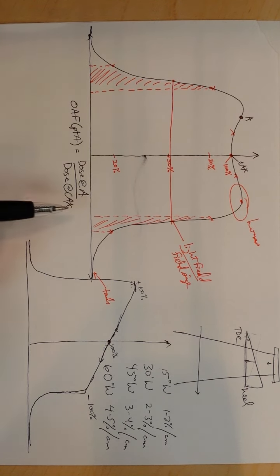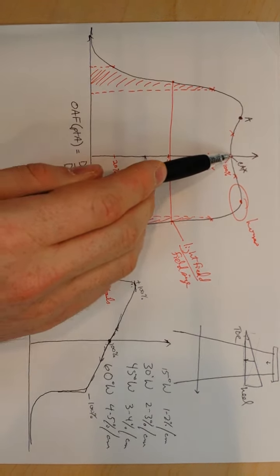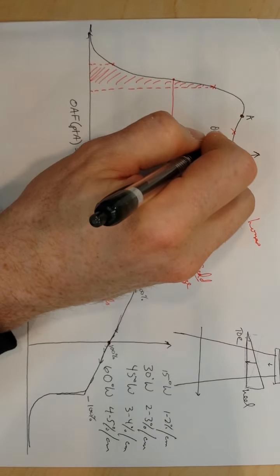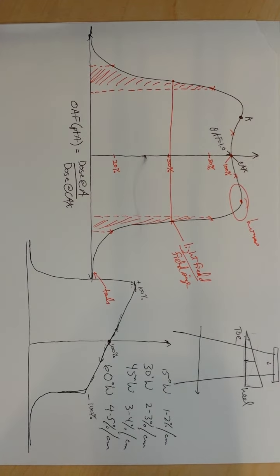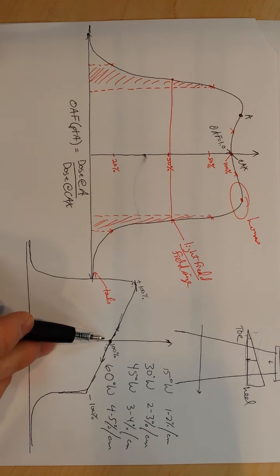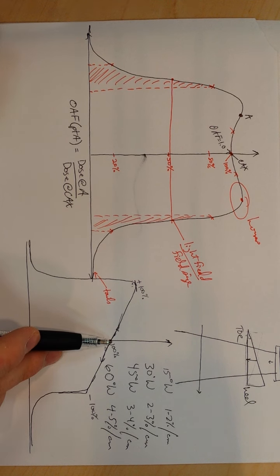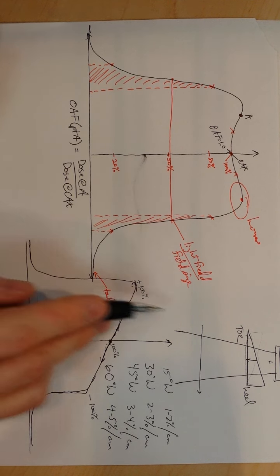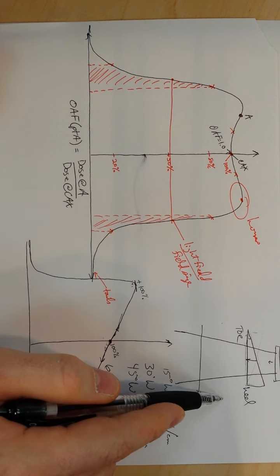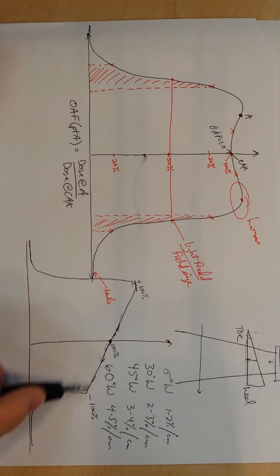Note that this is going to be greater than 1 for an open beam, because everything is normalized to 1.0 on the central axis. So off-axis factor equals 1.0 on the central axis. For an open field, it's going to be roughly plus or minus 3%, the entire length of the field. Not the case in the wedge field. So the wedge field that we drew earlier, if this is the wedge orientation across the beam and we scan left to right, this is the profile that we create.